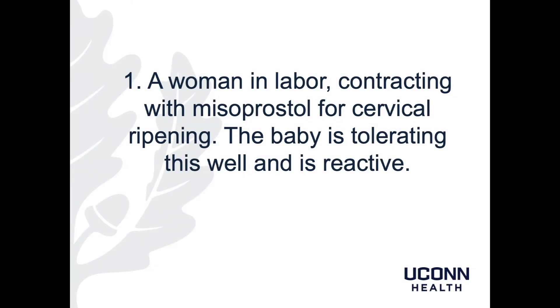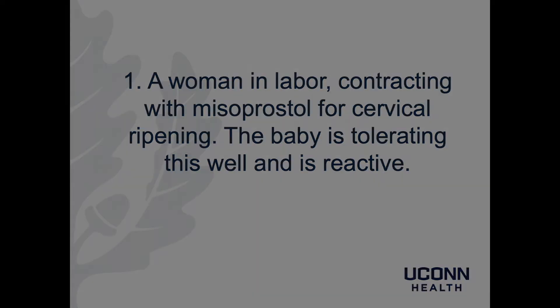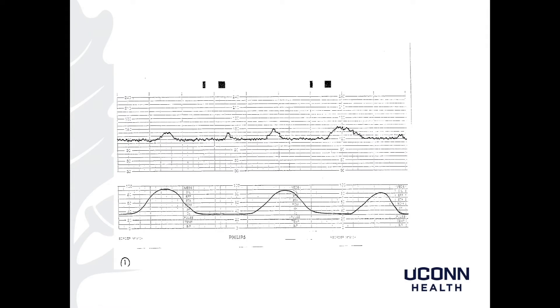Case 1 is a woman in labor contracting with misoprostol for cervical ripening. The baby is tolerating this well and is reactive. My read of this fetal heart rate tracing: baseline of 120s, moderate variability, accelerations are present, negative decelerations. That would make this a Category 1 fetal heart rate tracing.